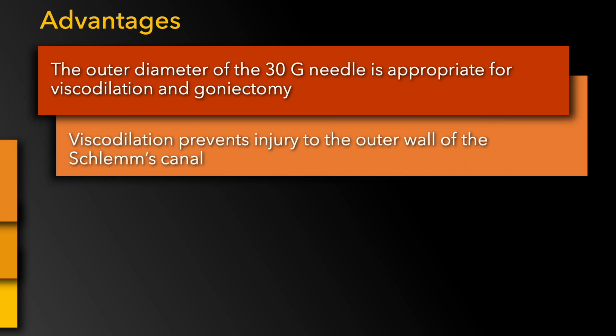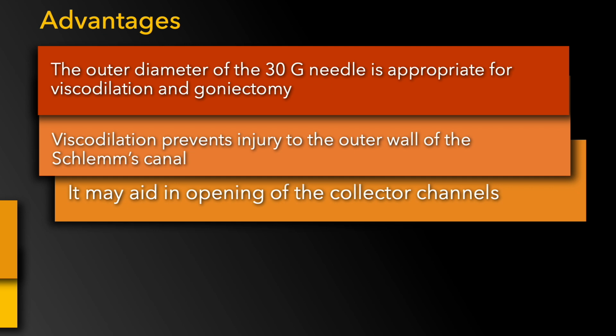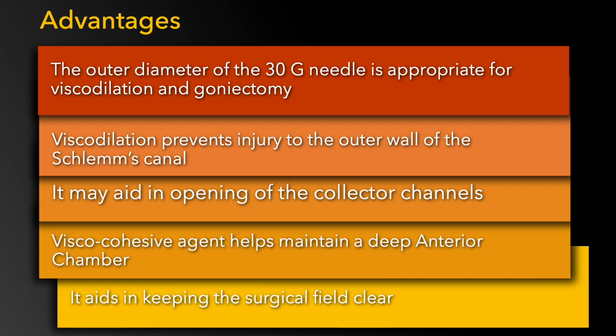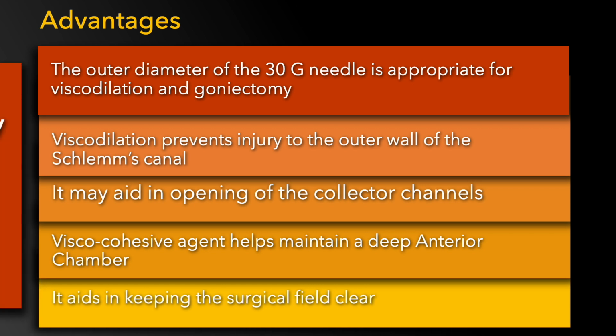The outer diameter of the 30 gauge needle is appropriate for visco-dilation and goniectomy. The visco-dilation prevents injury to the outer wall of the Schlemm's canal. The injection of visco-cohesive may aid in opening of the collector channels. Visco-cohesive agent helps maintain a deep anterior chamber during the procedure, and it also keeps the surgical field clear.